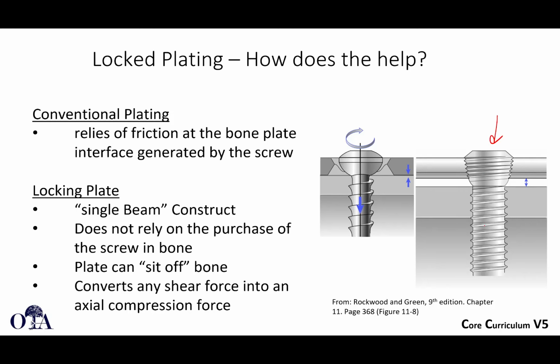It's not going to move in this direction, or three-dimensionally. I can't show that here. It's going to be a fixed angle. It's going to create this fixed angle here. So that's how it's different than a cortical screw here that can potentially move. I'm not showing that it's moving relative to bone, but this thing, instead of being here, can move like this or like this if the screw loosens. There's no fixation of the screw head to here. So this is where that toggle can start, and that's less likely to happen with a locking screw. In fact, it can't happen.